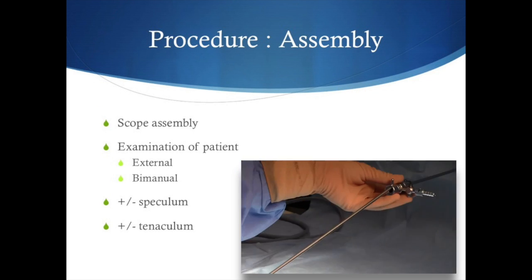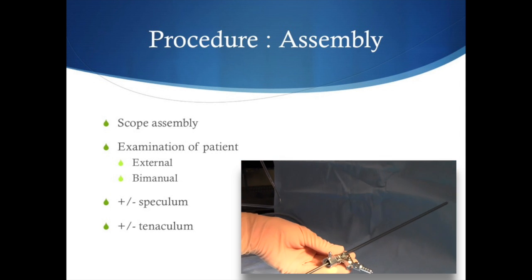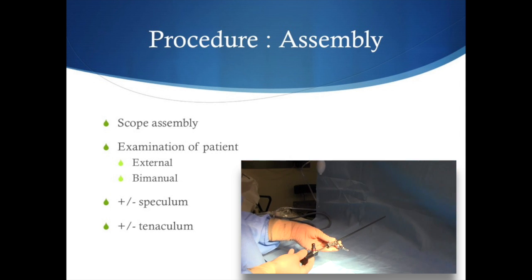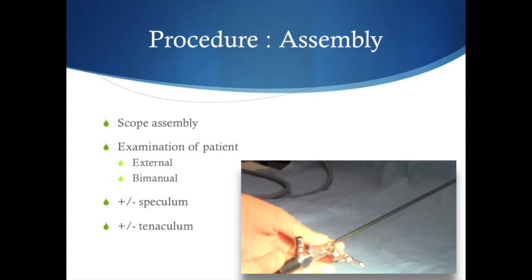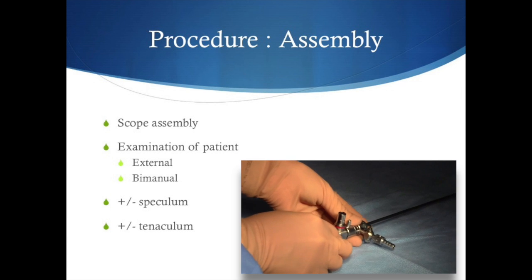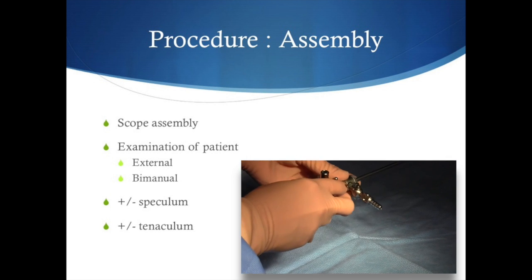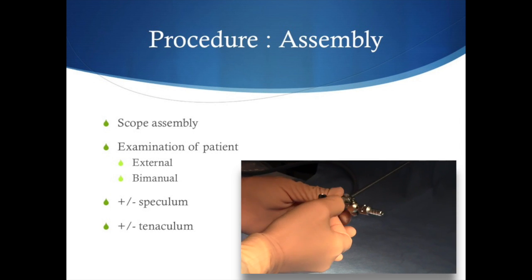The hysteroscope is assembled by inserting the scope into the outer sheath. The integrated locking system is employed to ensure that the scope and the sheath are securely attached.